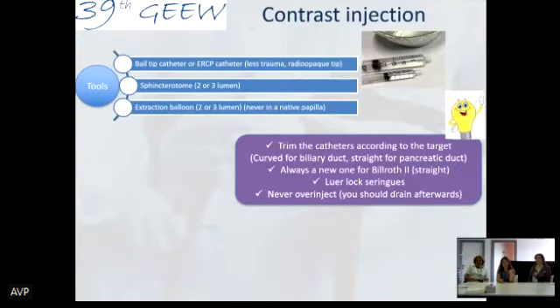And also when you do a hilum and you have intrahepatic bile ducts with strictures, you're not going to inject everything because you have to drain afterwards. So you will try to see the MRI beforehand, decide with your team what you're going to treat, to put the stent, for example, and then you will inject that one and then you will drain afterwards.